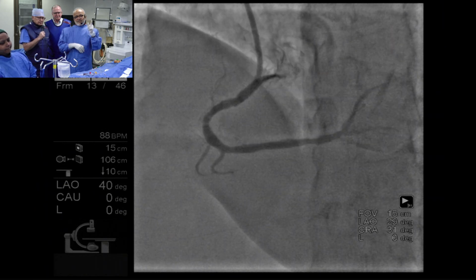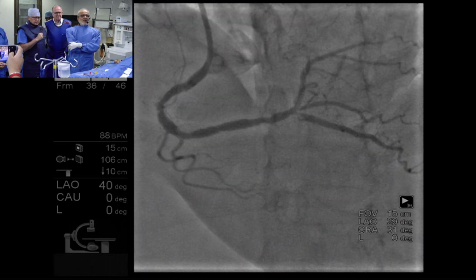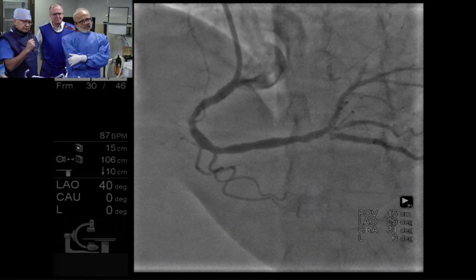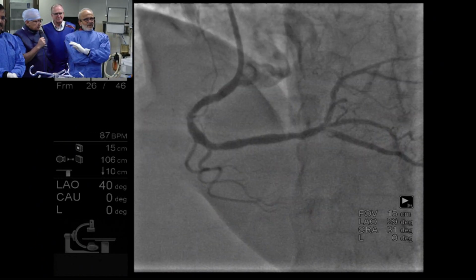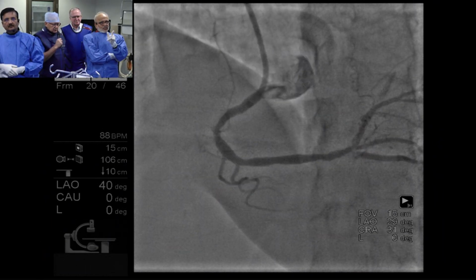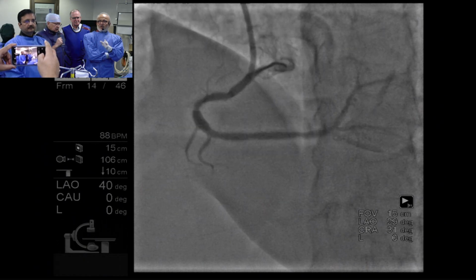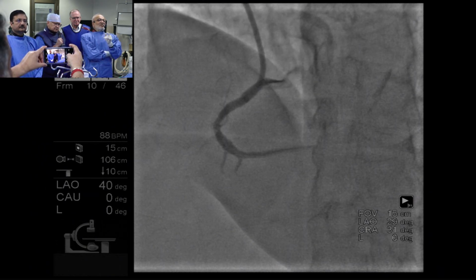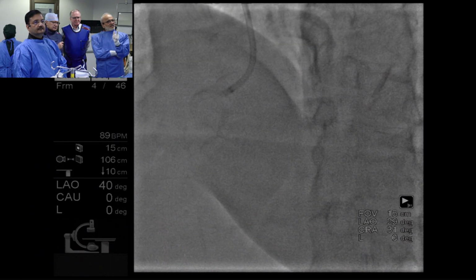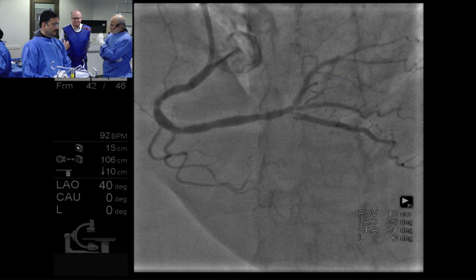If we go for provisional T again, whether you would like to put one wire or two wires? Yeah, of course, two wires. I tell you, two wires. It's a very good traditional thinking, perfect. But in this case, even if I put a single wire, PLV will not occlude, 99.9%, because you have something in buffer in between also. That is a small branch. So whenever we see such a small branch in between, that becomes protective to the larger branch. Malcolm, any comment on that?